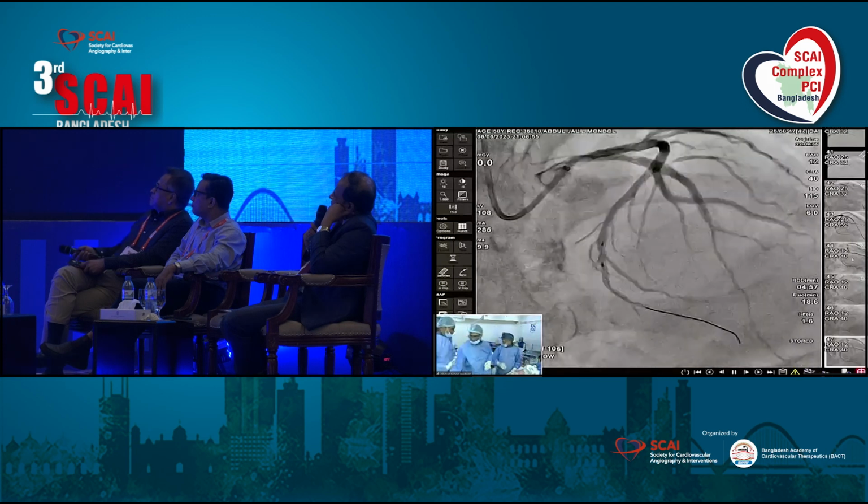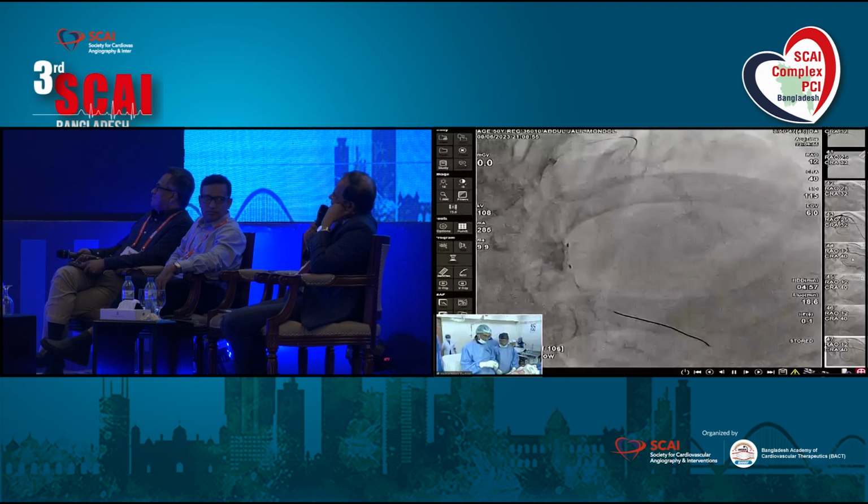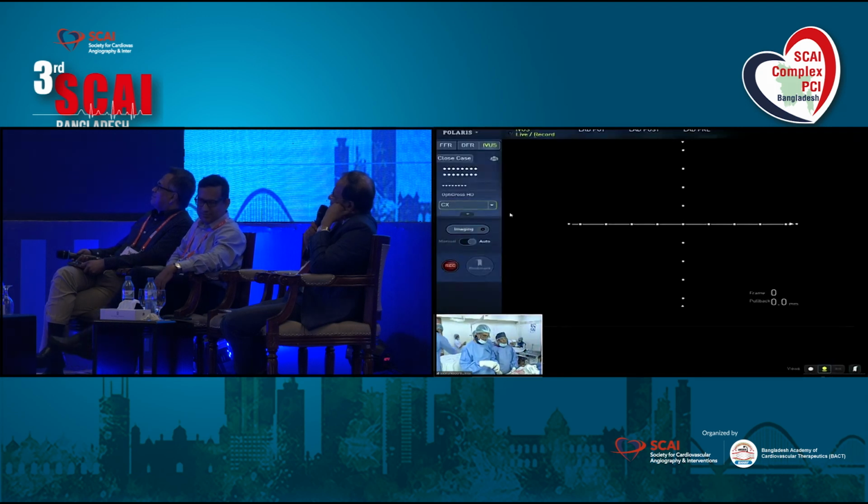Okay, we have IVUS, we can do this with IVUS also. Do you want to see IVUS? Yes, we can definitely see that. IVUS is a great idea. That can change your strategy.